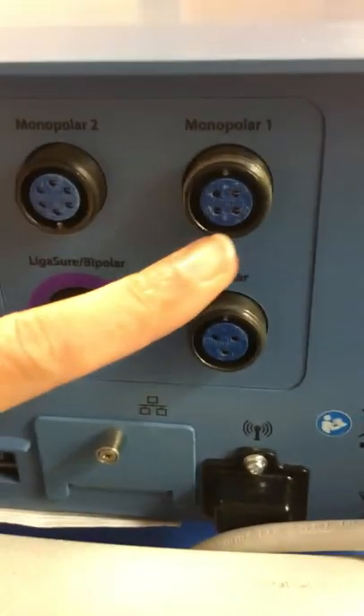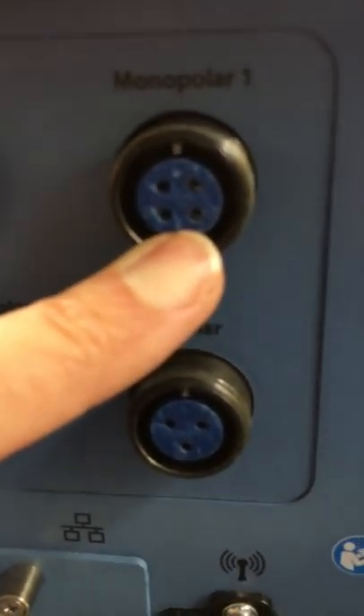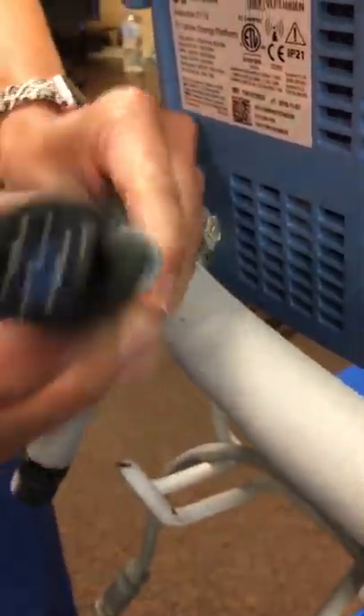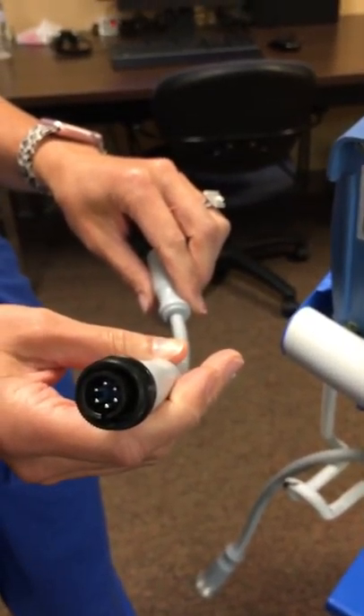If you've got a four-pin adapter for your foot pedal, that will go here just fine — as you can see there are four holes that those pins would fit in. However, if your foot pedal is a six-pin, which looks like this, then you would need to plug in this pigtail adapter, and that would allow you to plug in your six-pin foot pedal into monopolar one.